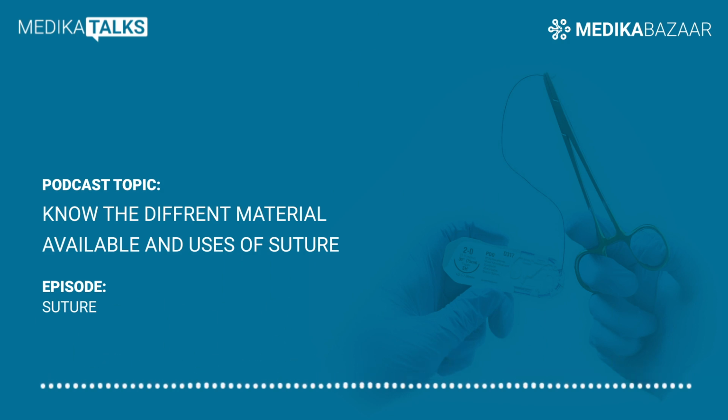Broadly, sutures can be classified into absorbable and non absorbable materials. They can be further subclassified into synthetic or natural sutures, and monofilament or multifilament sutures. The enzymes in the body tissues can naturally digest the absorbable suture, which is why doctors do not need to remove them. However, the non absorbable sutures are usually removed after a few days of the surgery. They may also be left in the body permanently based on the type of surgery that the patient has undergone.